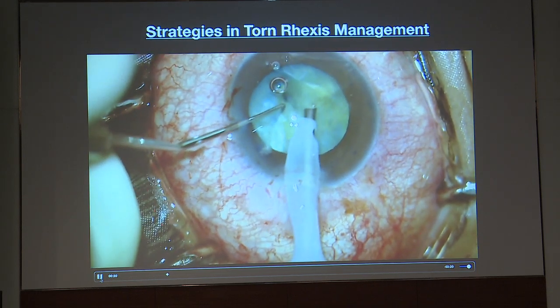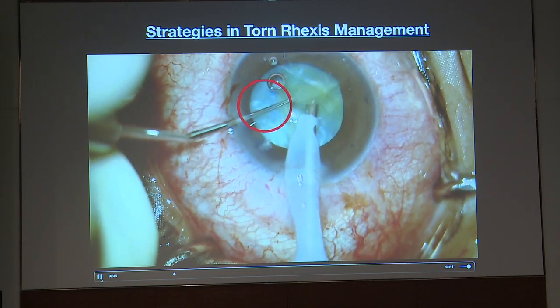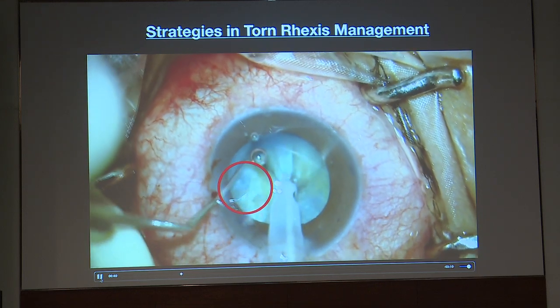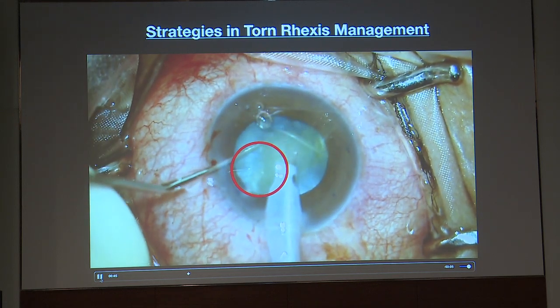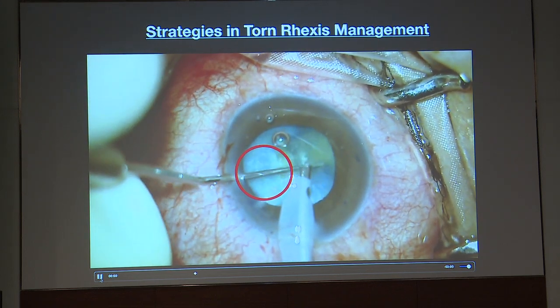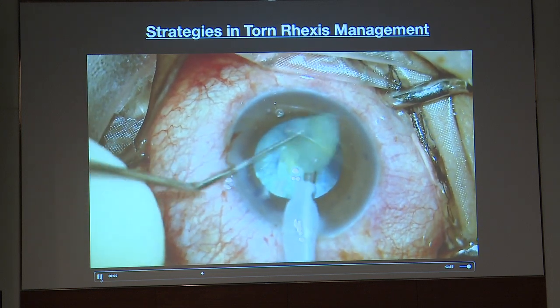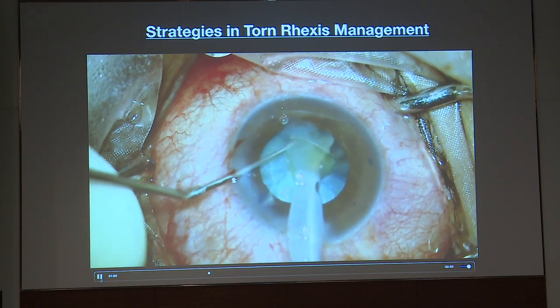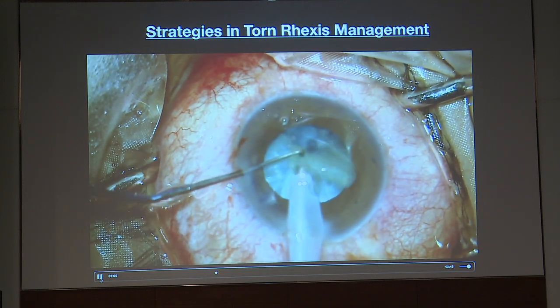At the same time, my focus was on the trypan blue stained anterior capsular tear. It was fluttering and everted. Nuclear emulsification was done at iris plane. Fluttering flap meant the tear had not extended beyond the equator. That gave me full confidence to continue the surgery with safe phacoemulsification technique. Had the flap become inverted and non-fluttering, it would have meant that the tear had become a wraparound post-equatorial tear.